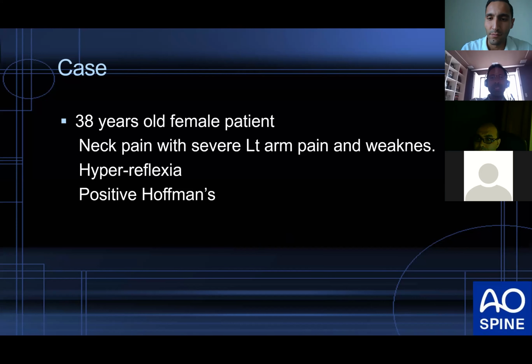In this case, as we have this big experience with TDR, we sometimes want to push the limits of the indications a little bit. And the clinical result in this case speaks for itself. We have this patient with more than 4 years of follow-up. The prosthesis is mobile, the patient is symptom-free, and amazingly, you didn't see any regrowth of the anterior ligament calcification. As for the trauma case, I fully agree with you. There is no point in doing arthroplasty in trauma patients.